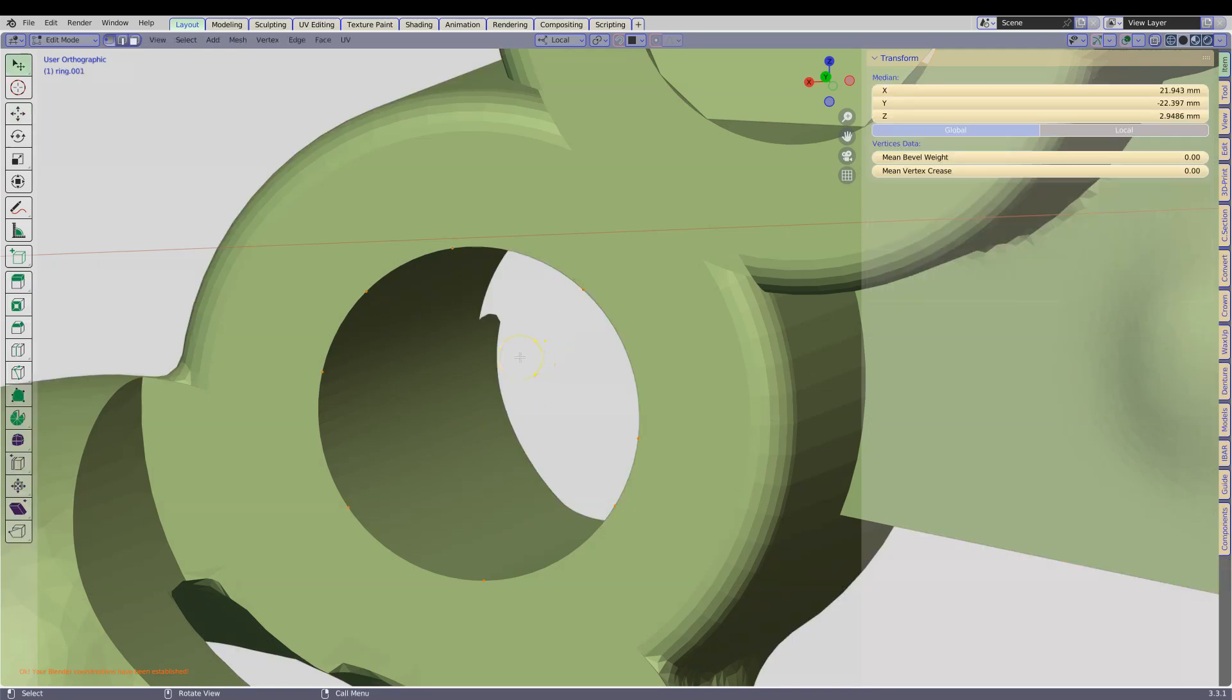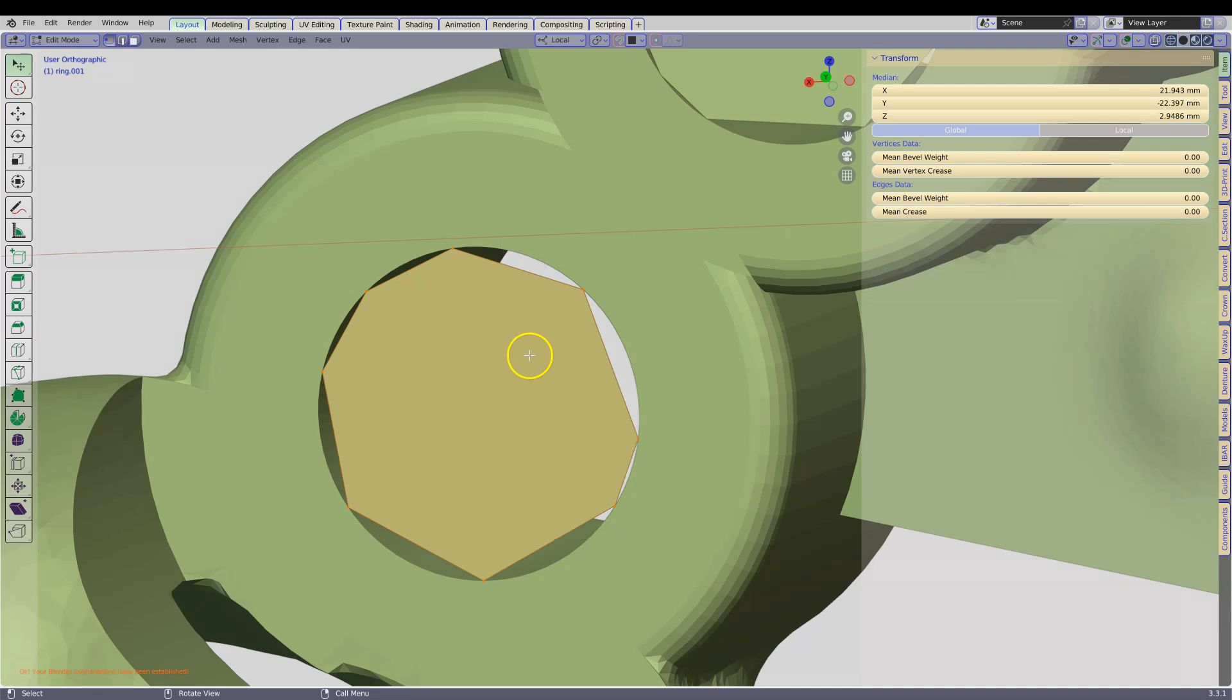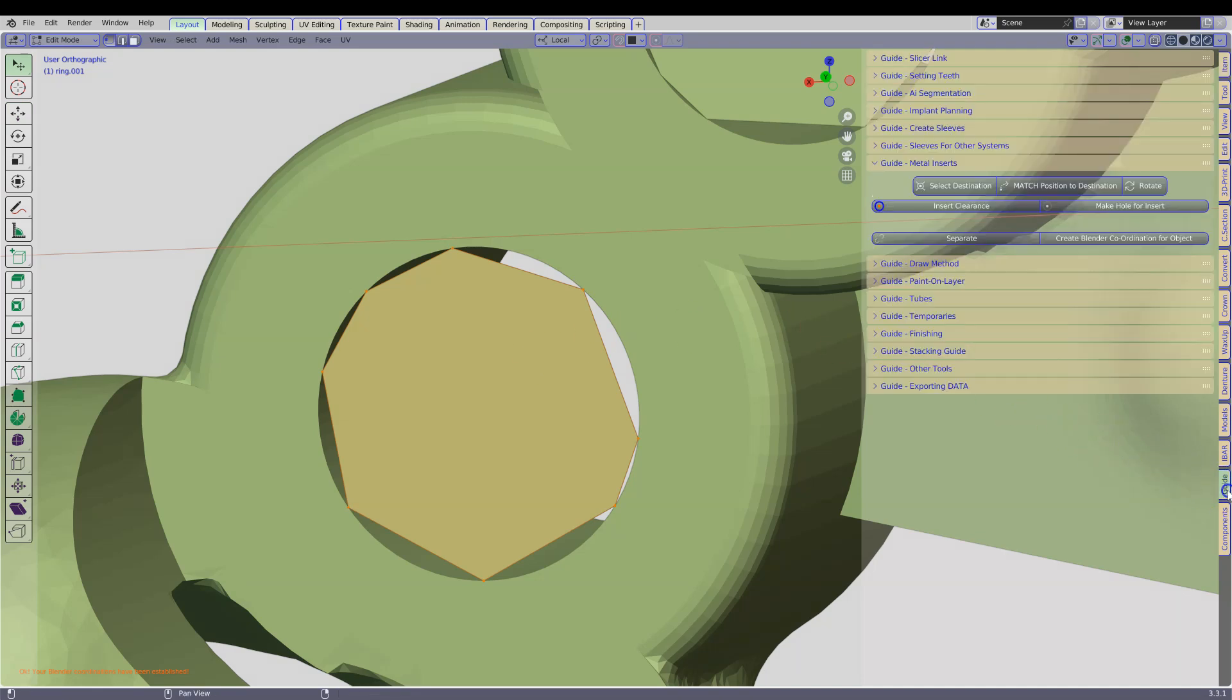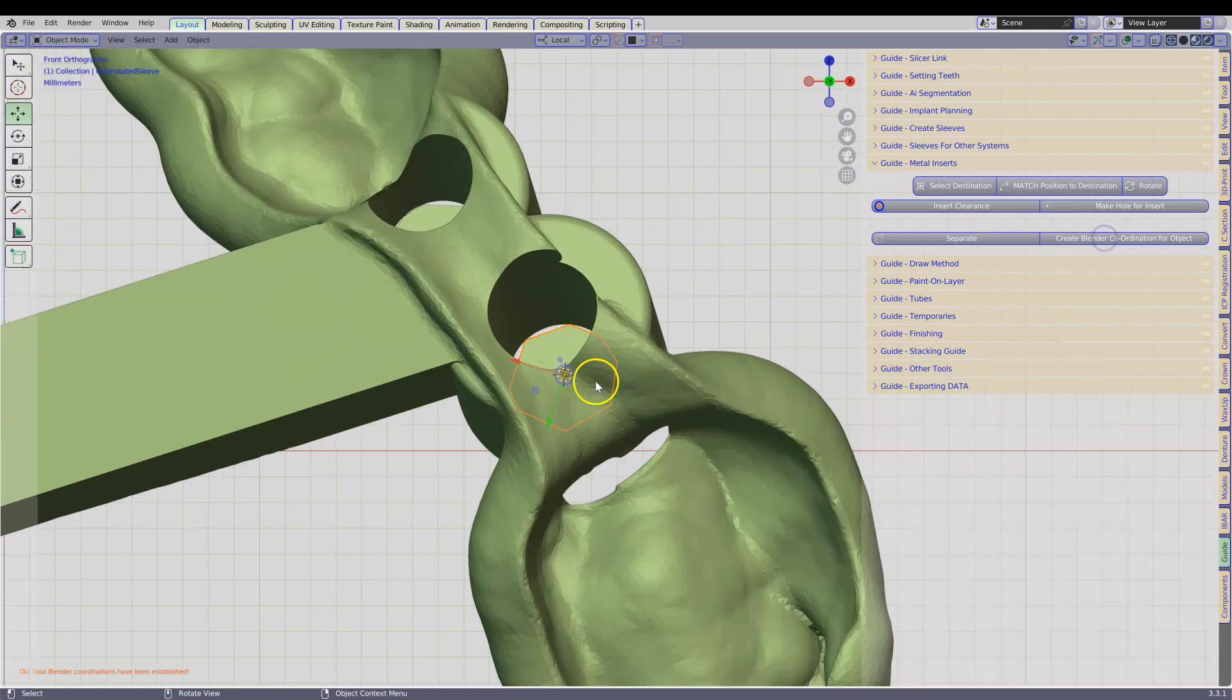Tab, A and F, go to the guide, and you are going to click create blender coordination.